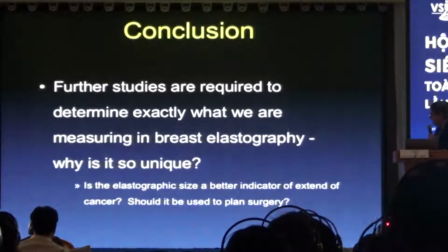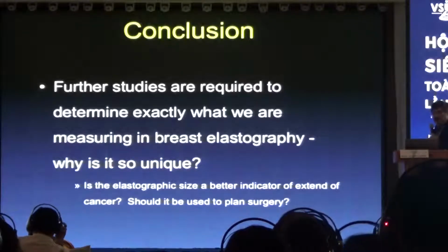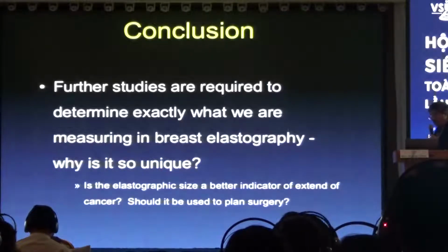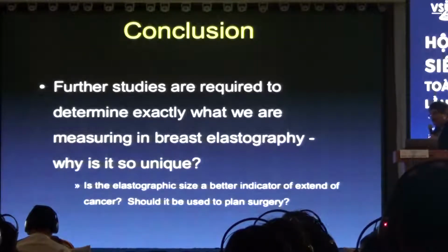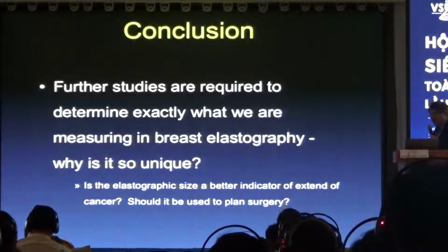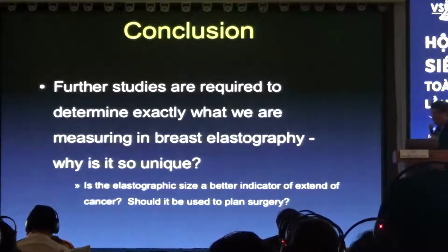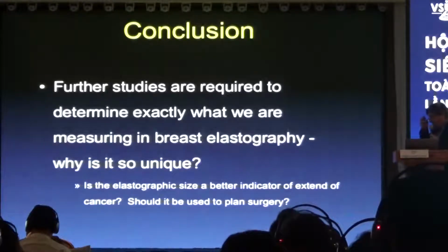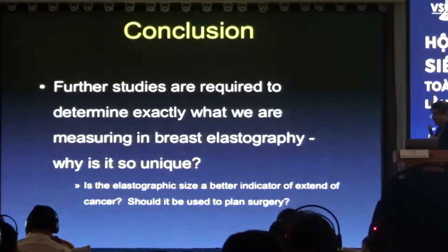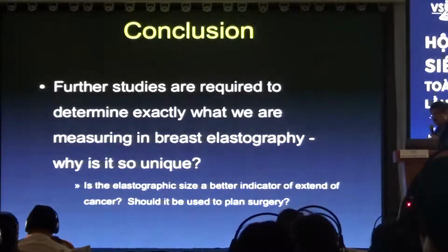And then, one of the things that I'm very interested in is, for some reason, all these things are very unique to breast. They don't happen in any other organ. We don't know why. And it's not because of desmoplastic reaction, because why does a benign lesion get smaller? There's no anti-desmoplastic reaction. So we really don't understand what we're doing, but we know from doing thousands and thousands of cases that it works. And we do this in every one of our breast cases, and like I said, we've been able to really decrease the number of biopsies and remarkably improve our accuracy in characterization of breast lesions.